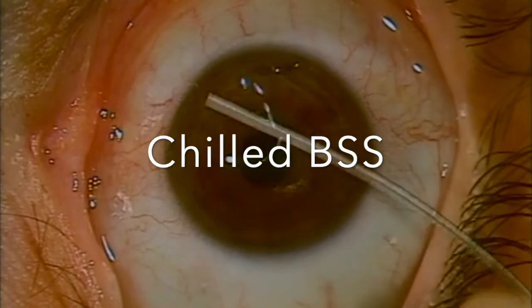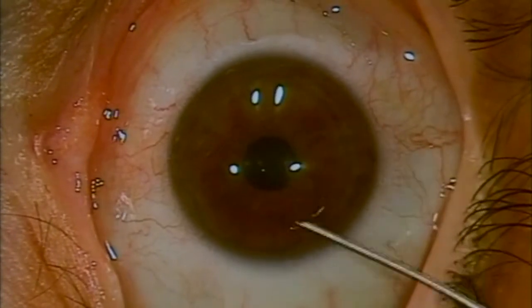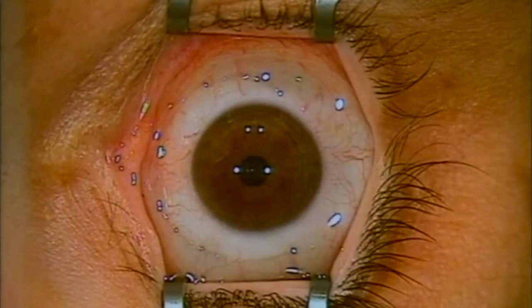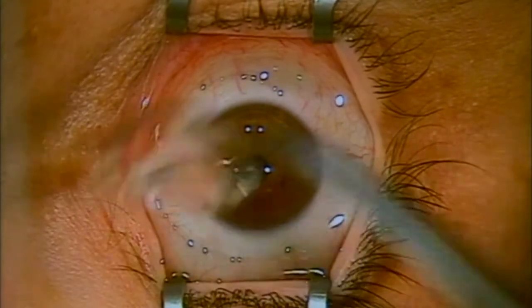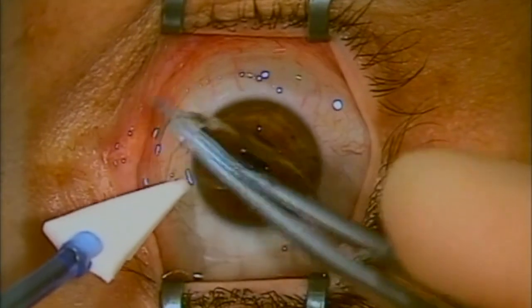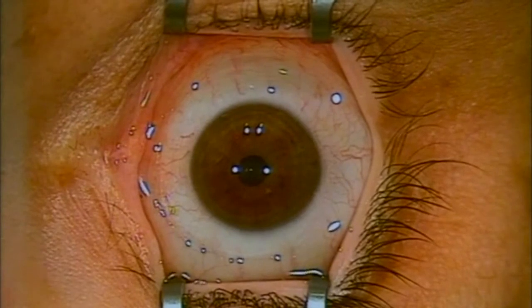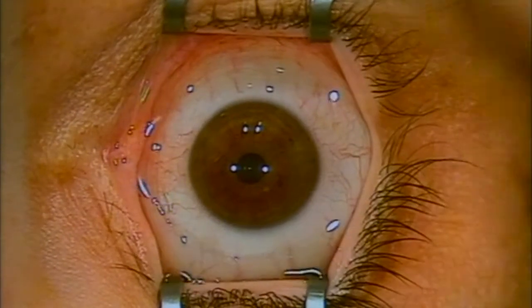Then we're straight on to the application of chilled BSS, and the tip here is to drop it on gently rather than squirting it onto the eye — that's more comfortable for the patient. A final tip: once you've applied the mitomycin, done the irrigation and put on your drops at the end of surgery, put your bandage contact lens on upside down. This is a tip from Pallikaris, the father of LASIK, and it avoids getting air bubbles underneath the contact lens.